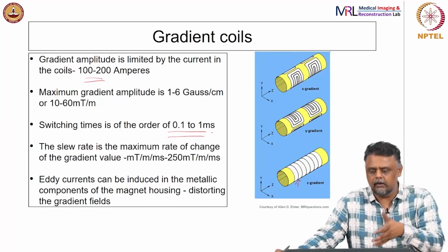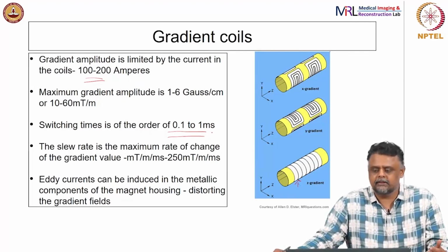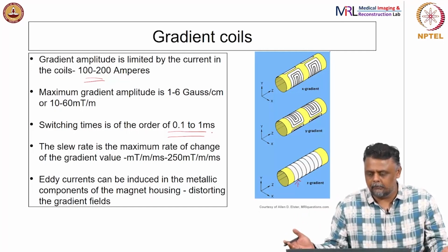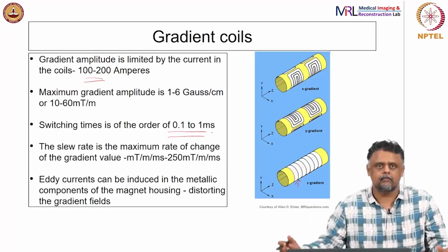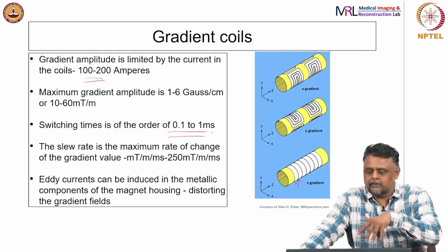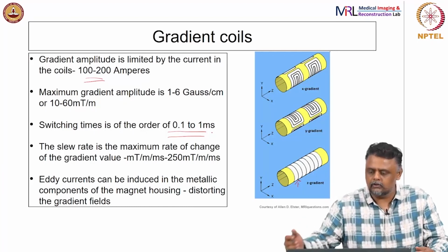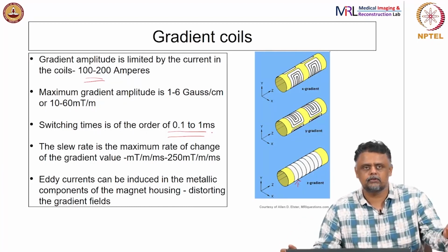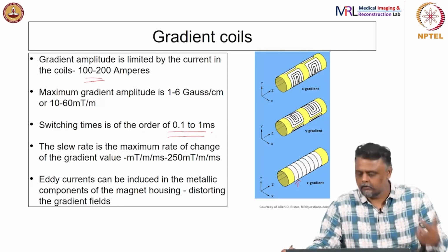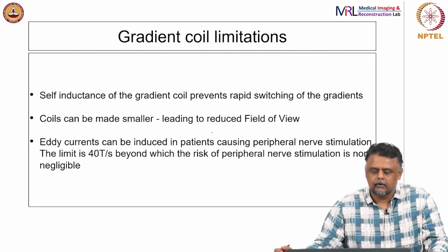Okay. So, once again here we go deeply into hardware. These are the hardware challenges in designing a magnet for an imaging system, right. So, you can imagine, we have the cylindrical core, you already have a superconducting wire, which is of course inside a vacuum, on both sides there is a vacuum, so it does not touch anything. But still introducing these current carrying wires will lead to some distortion in the magnetic field, and these current carrying coils are wound around in specific shapes. We saw saddle coils, and these are circular coils, etc., and they will also produce some distorting field. How do you handle all that?